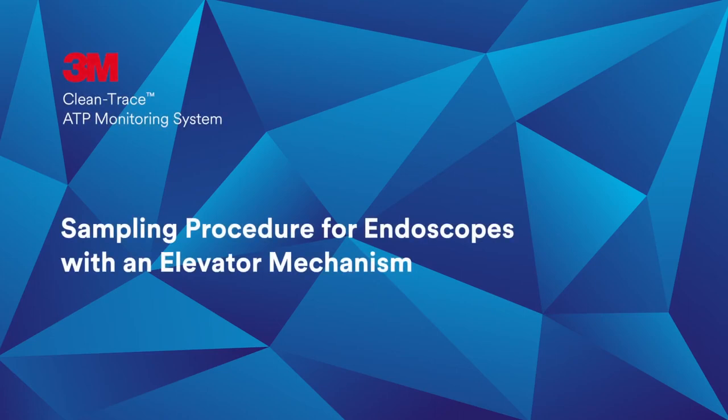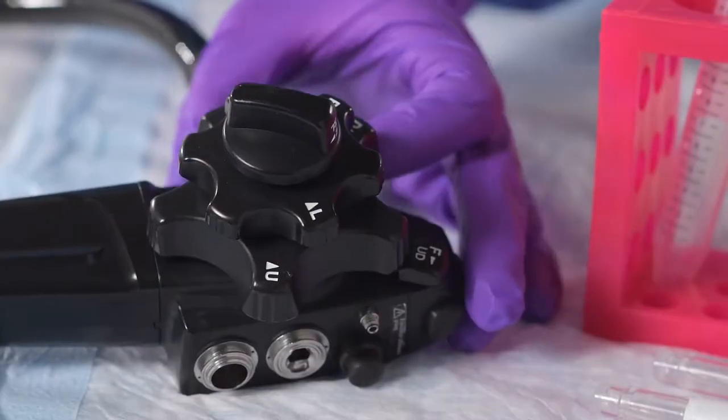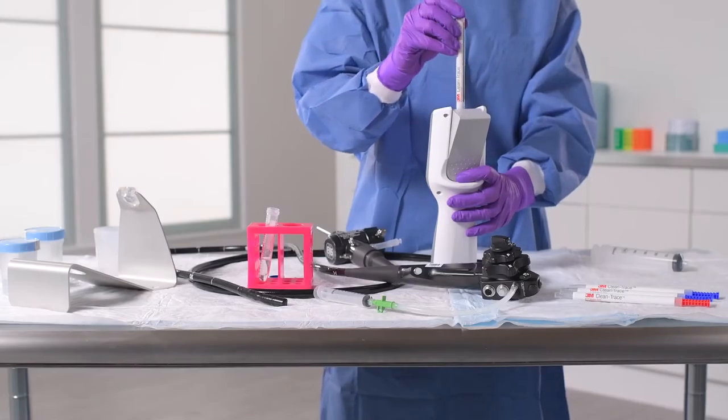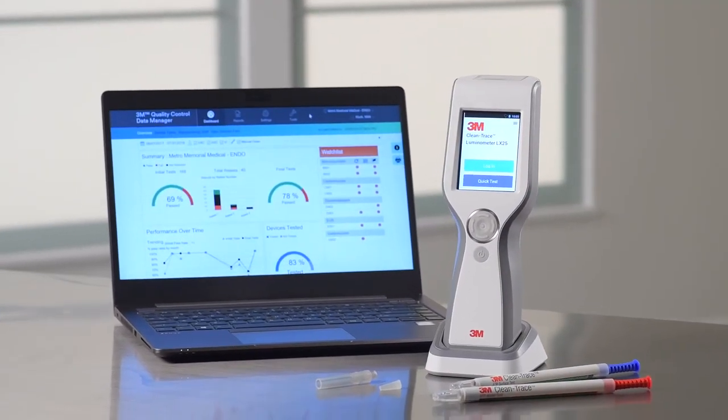Hello and welcome to the 3M lab. In this video, you will learn how to collect a sample from a duodenoscope or any endoscope with an elevator mechanism to measure cleaning efficacy using the 3M CleanTrace ATP Monitoring System.